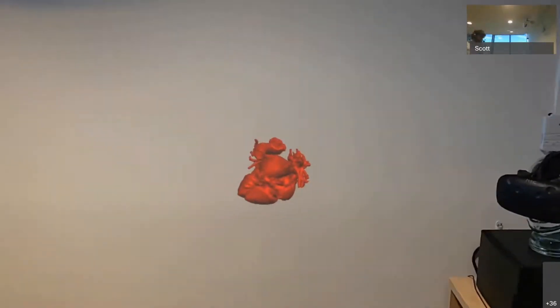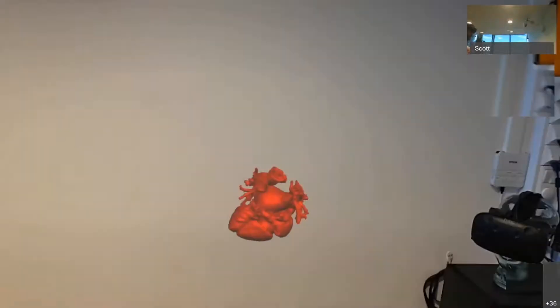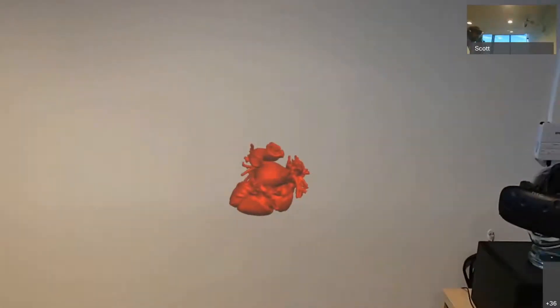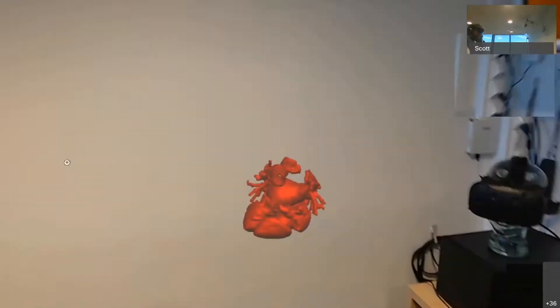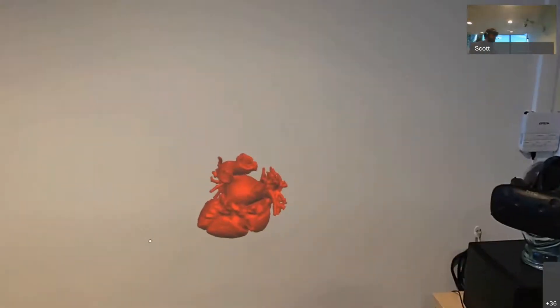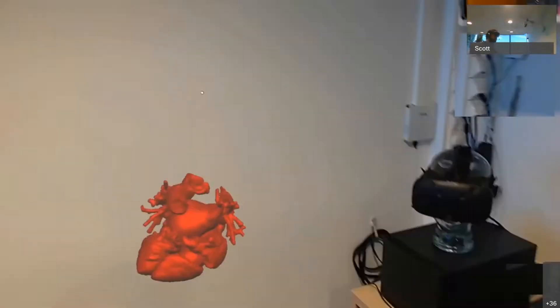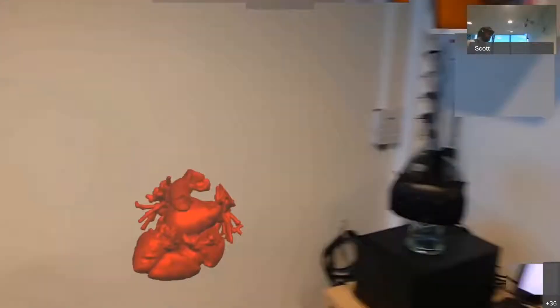So I'm using the application by myself today, but normally, in normal practice, you'd have multiple people in the same room looking at the same heart in the same place and having a conversation around it.